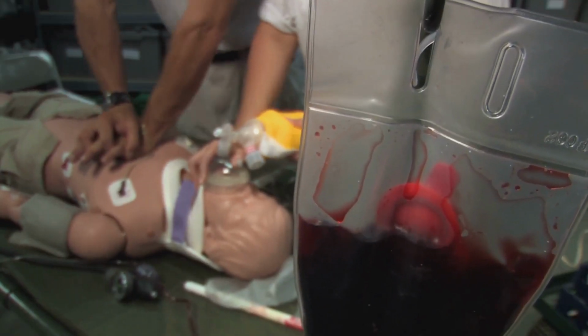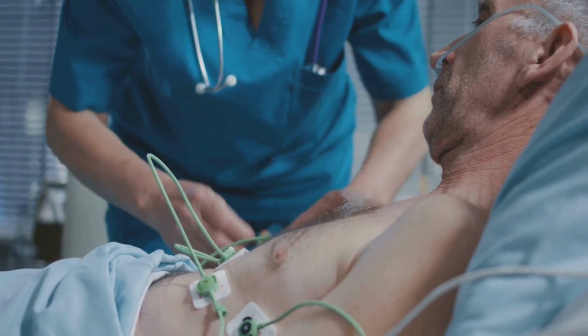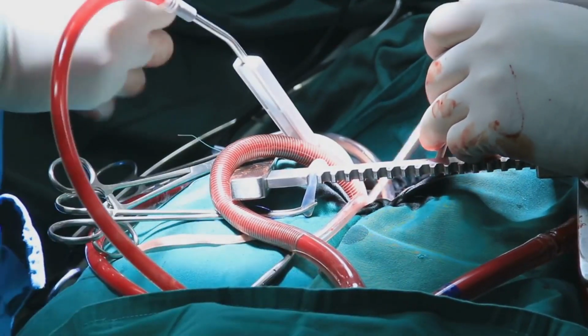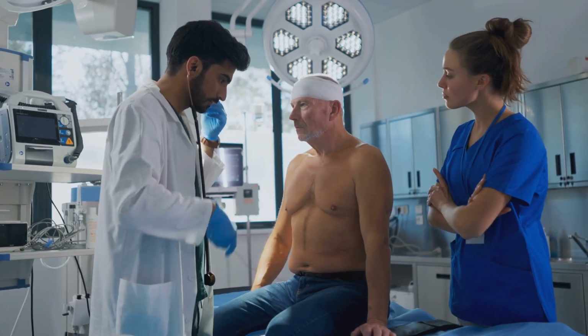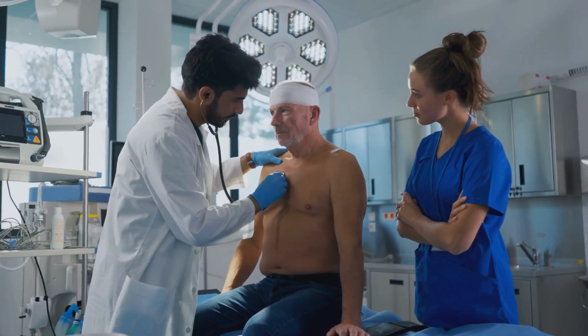Simulation time. What if the chest tube gets dislodged? Immediately cover the site with a sterile occlusive dressing and call for help. Excessive drainage? Quickly assess the patient's hemodynamics, document, and escalate. Stay alert for complications, breathlessness, hypotension, sudden changes in drainage, and always document your assessments.